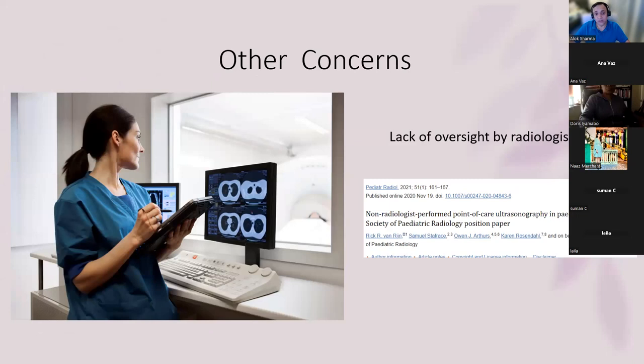Alternatively, you might not have a 24/7 pediatric or adult radiologist who can actually come and hold your hand. What do you do about making treatment decisions in those circumstances? In low resource settings, I've just finished a study with Dr. Suryavanshi, and we've done a survey of about 100 colleagues who've been learning point of care ultrasound over the past 3 years.